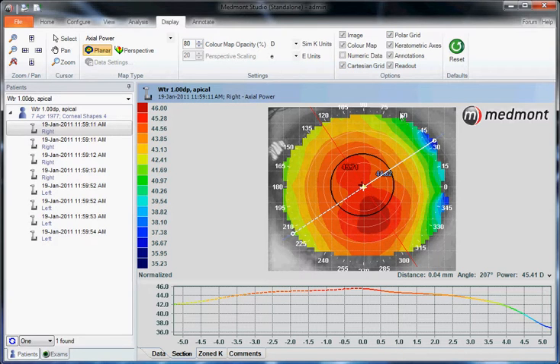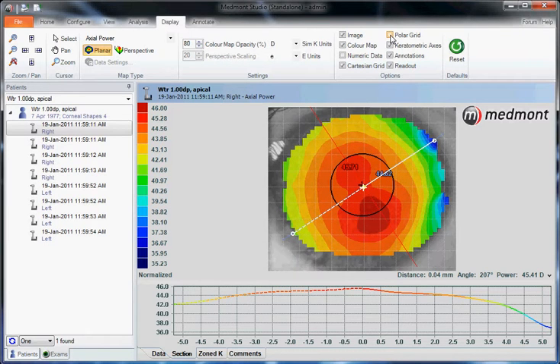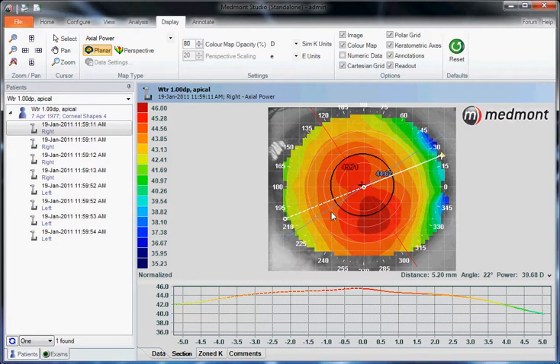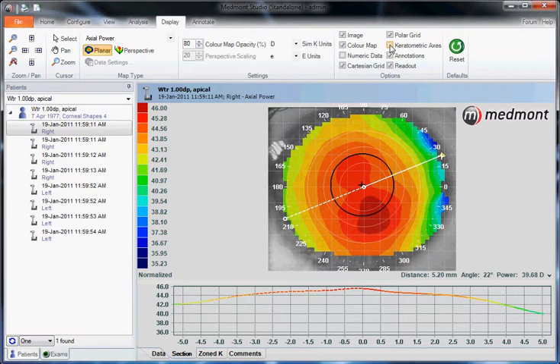The polar grid provides these axis lines all the way around the clock — you can uncheck or check it. The keratometric axes provide the flat axis shown as the blue line, the steep axis shown as the red line, and the key readings — so where the topographer thinks the flat and steep axes are. You can uncheck or check those displays.